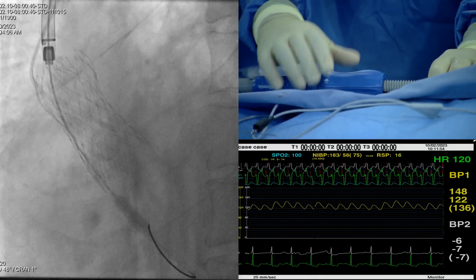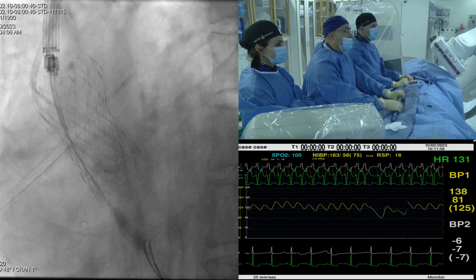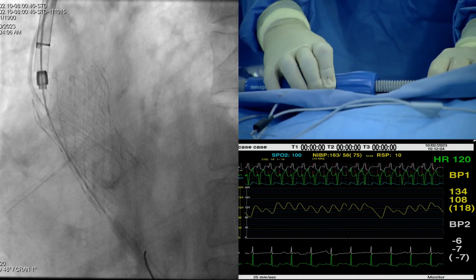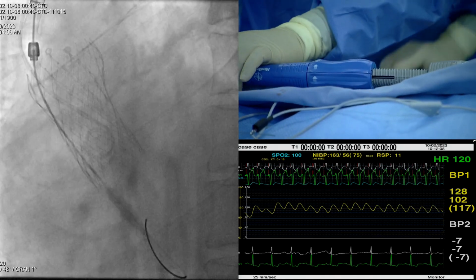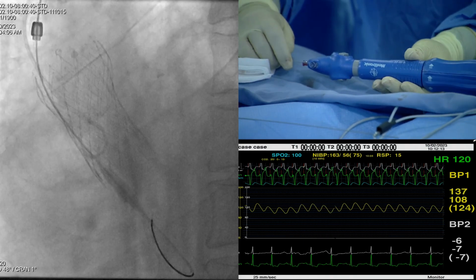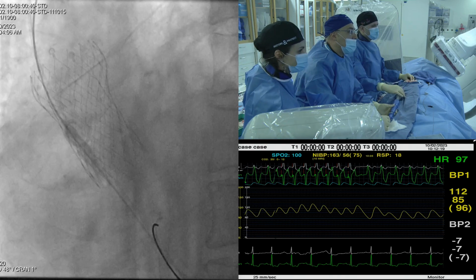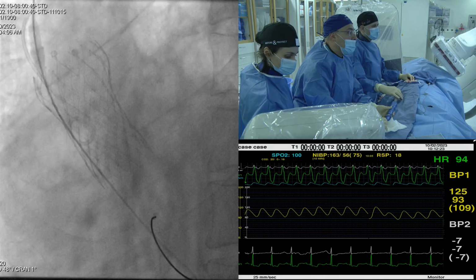I think it's perfect. I have another question for all of you, including yourself, Danny. I have a tendency to let the valve sit there for a period of 4 to 5 minutes for the nitinol to expand and the valve to get stable prior to release. That's the time it would take for it to stabilize and expand well. Do you practice that at all? Never?